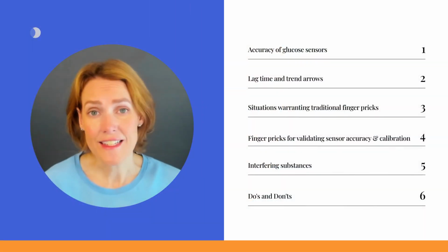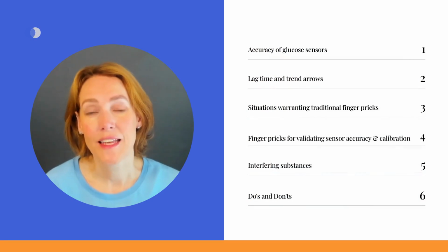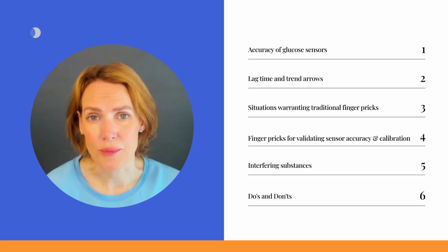While glucose sensors can be relied upon for insulin dosing, it may take some time for individuals to fully trust the sensor readings. It is important to acknowledge that all technology can have failures, and glucose sensors are generally less accurate than finger pricks. If your sensor reading does not match how you feel, always verify your glucose level with a control finger prick. By following these guidelines, glucose sensors can be a reliable tool for insulin dosing and can significantly ease the management of diabetes.